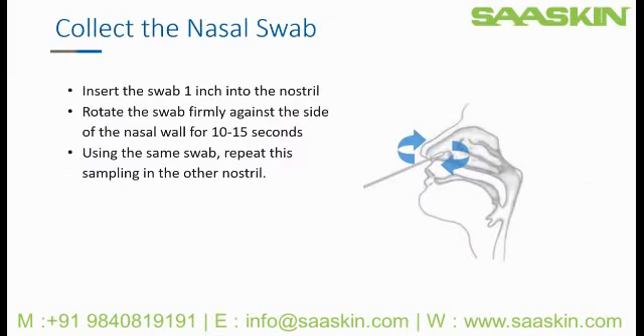To collect the sample, carefully insert the swab approximately one inch into the patient's nostril or until you feel slight resistance. Rotate the swab firmly against the side of the nasal wall for 10 to 15 seconds.